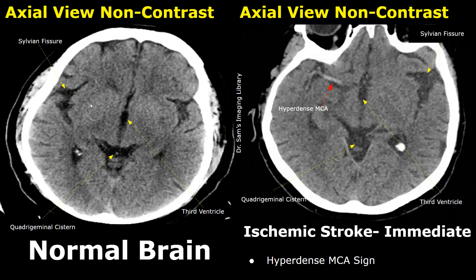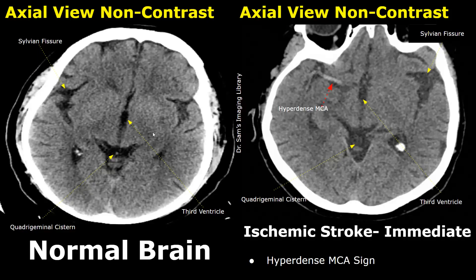On the left side is a normal brain in axial view. The outer layer of the cerebral cortex consists of gray matter and it is slightly hyperdense, slightly brighter than the deeper structures. This deeper layer of cerebral cortex consists of white matter and it appears slightly hypodense or slightly darker than the outer layer.